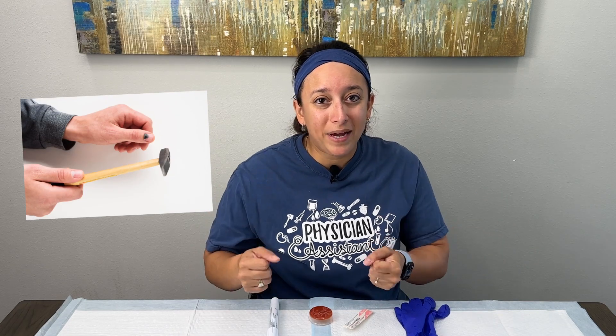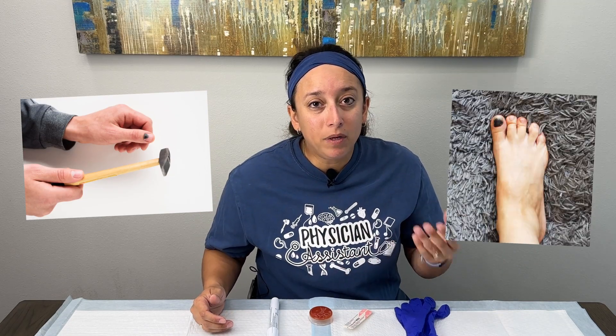As a PA in the emergency department, we see subungual hematomas come through the door pretty frequently. People accidentally slam their finger in car doors, they accidentally drop weights on their toes, and blood accumulates underneath the nail bed. When we have this come in, there are several different techniques we can take to evacuate that blood and help our patients feel better.